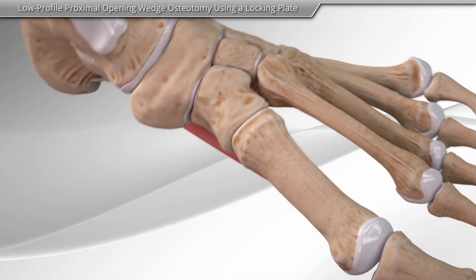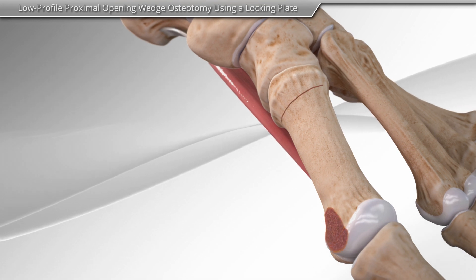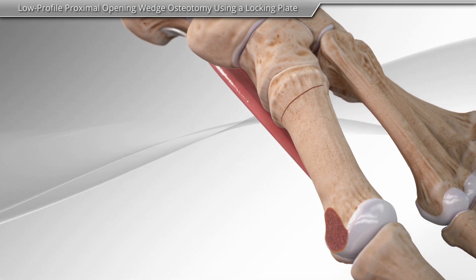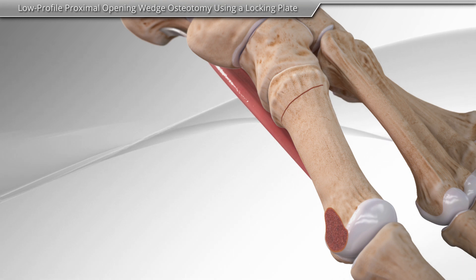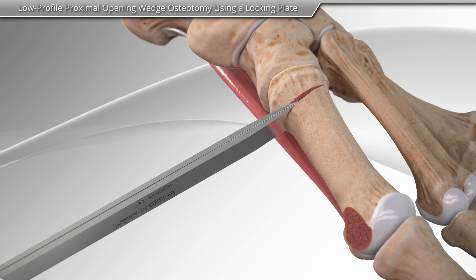First, your surgeon will make an incision over the base of the big toe. Next, a cut in the bone, or osteotomy, is made at the base of the big toe. Special instruments are used to help move the bones into a more normal position.